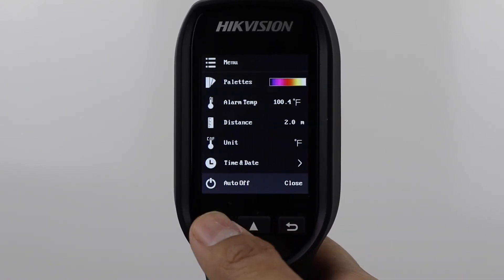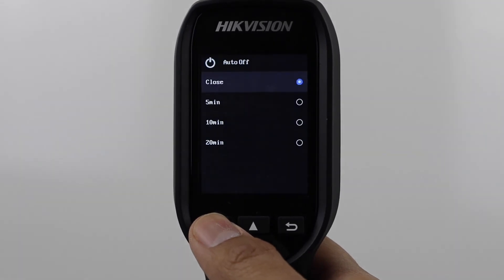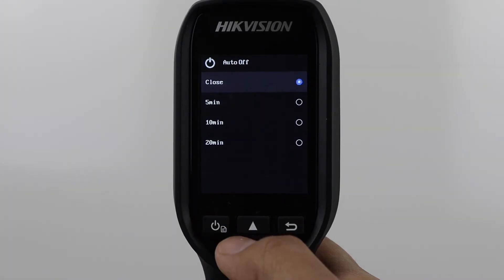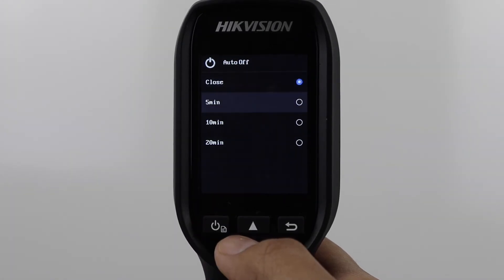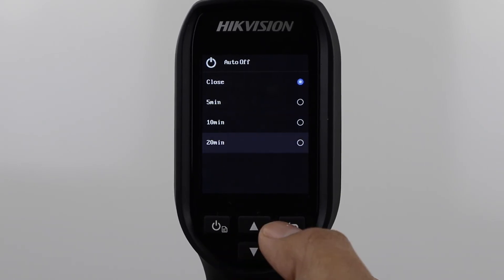Auto-off is a power saving feature which makes the camera automatically shut off after a set period of inactivity. You can turn this off completely or increase it up to a maximum of 20 minutes.